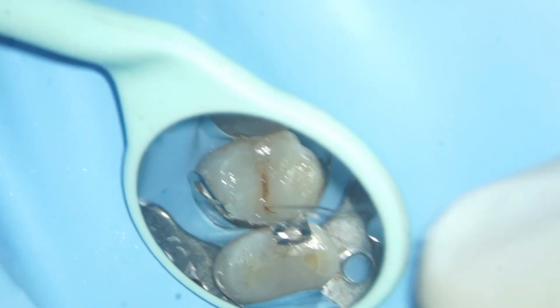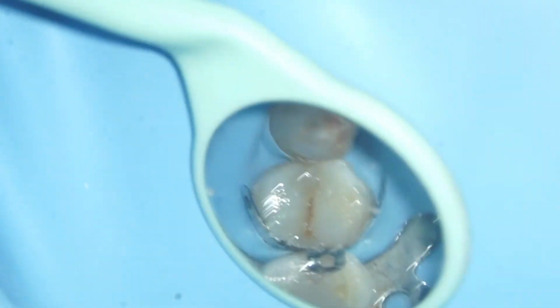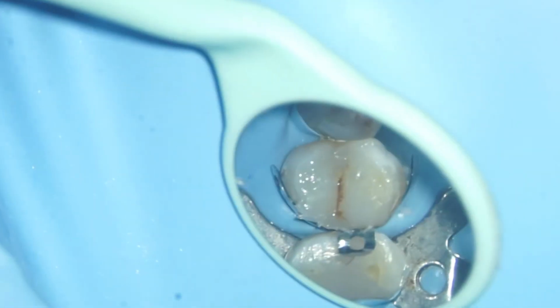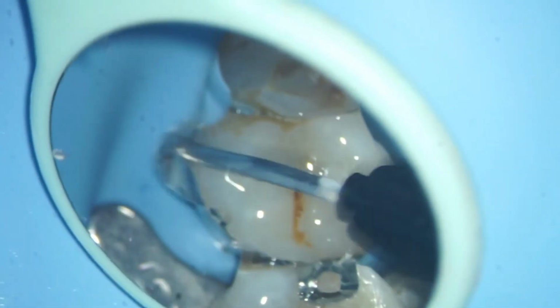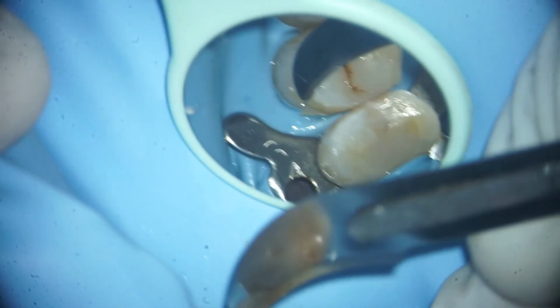So here we are using some tints. They just add to the look of your restoration. They do not have any functional role, but you should start trying them to achieve those natural, beautiful anatomies. Finally, they are cured under a layer of glycerine to prevent the atmospheric oxygen from inhibiting the polymerization of the composite. This is the most important step.